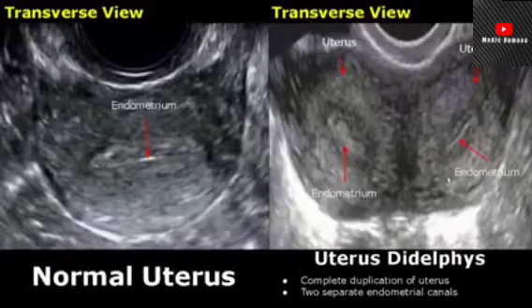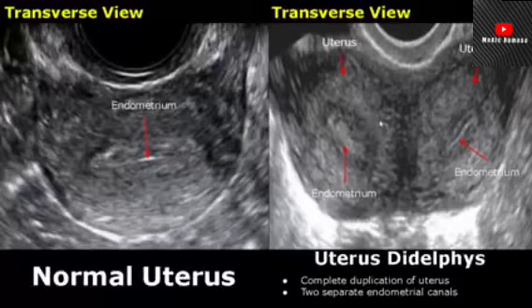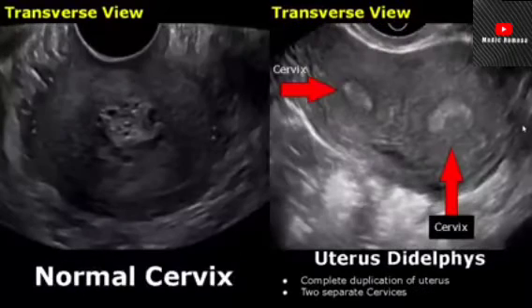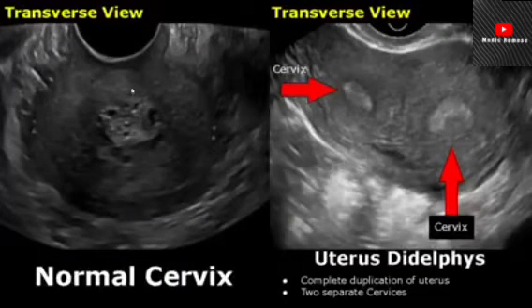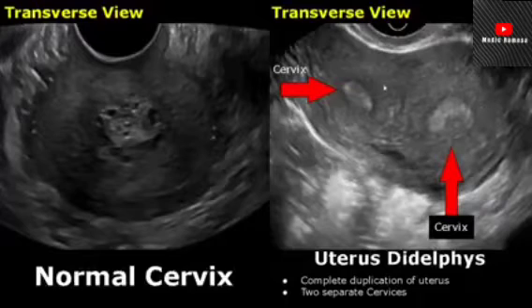Here we have transvaginal images in the transverse plane. This is the normal uterus and this is uterus didelphys — we can see two separate uteri and two separate endometrial canals. In the cervix images taken transvaginally, there are two separate cervices as well, because there is complete duplication of the uterus.